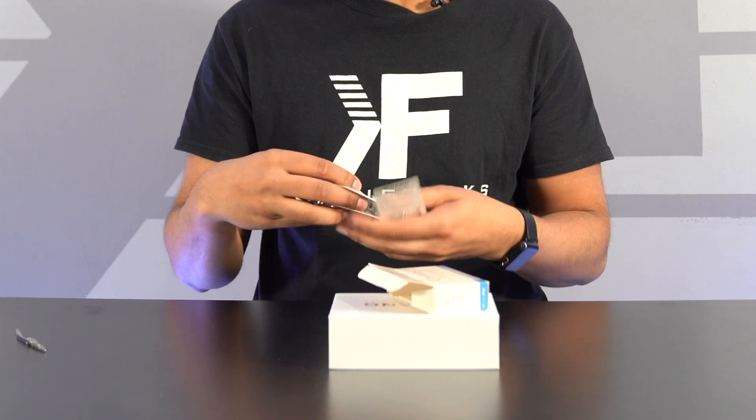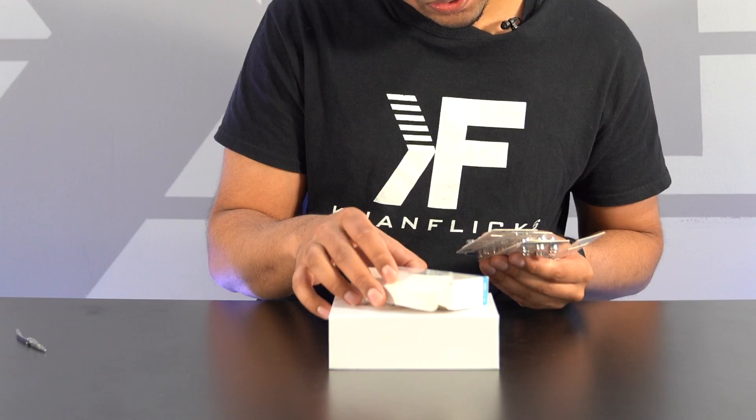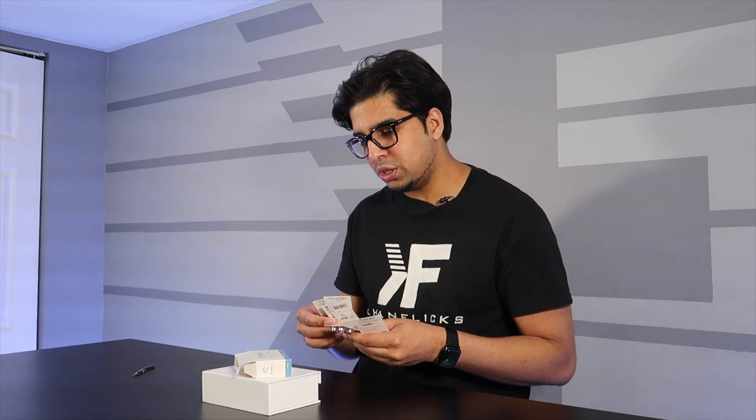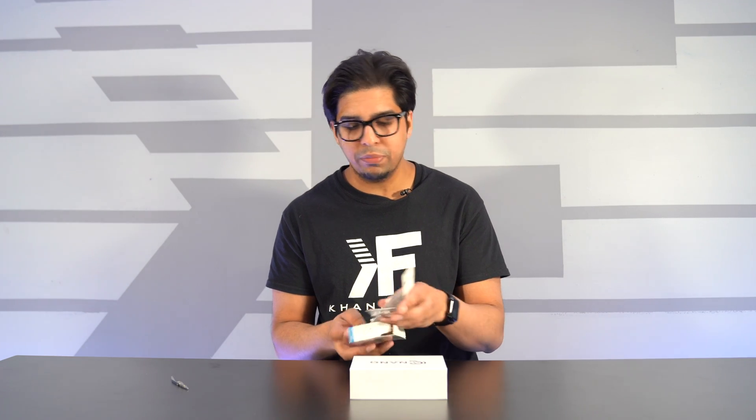Before we open up the hearing aids, you get this battery pack here — a total of 36 batteries, so this should last you a good amount of time. These are very standardized PR48 batteries; you can buy them anywhere or from the Nano website.